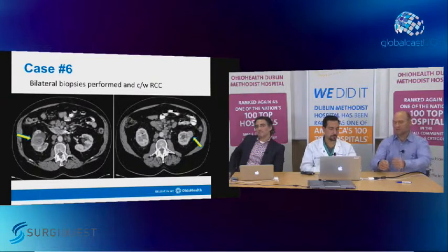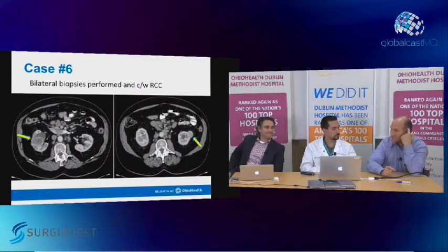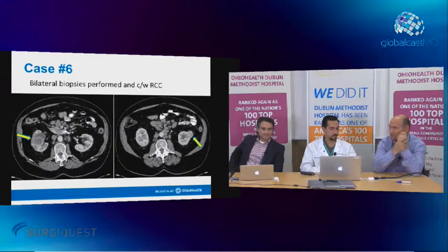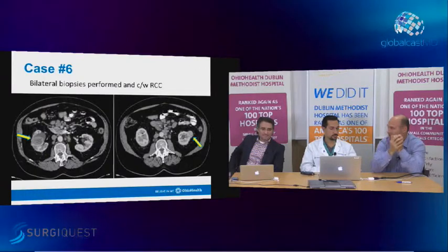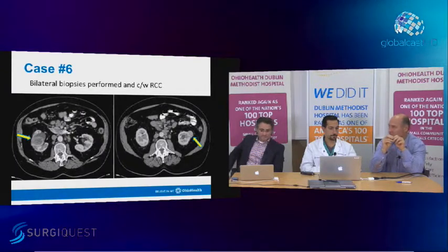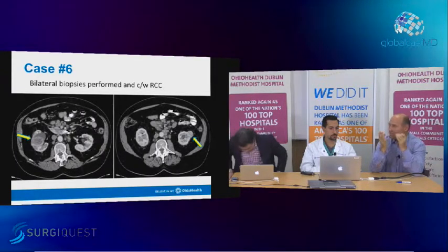So I would do, my rule on bilateral tumors is to do the easiest one first. The reason for doing the easiest one first is that if you start doing this right-sided tumor being central, and that becomes a nephrectomy, all of a sudden you're doing a solitary kidney on the left. No matter how simple that is, that's still a much higher pressure case. So your best option is to do the simplest tumor first with the best chance of doing a partial nephrectomy. Let that kidney heal up.